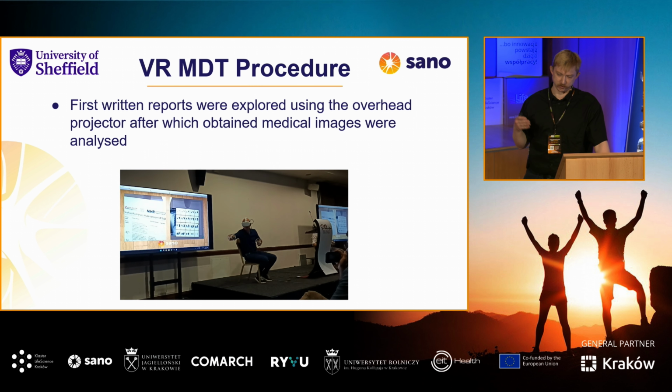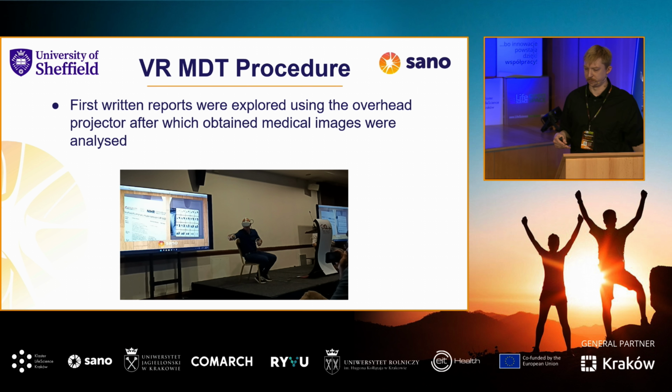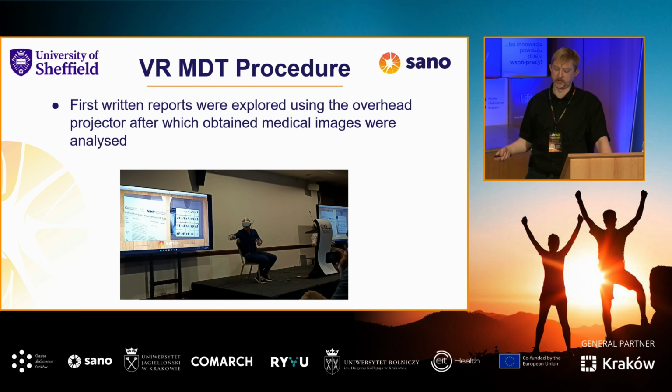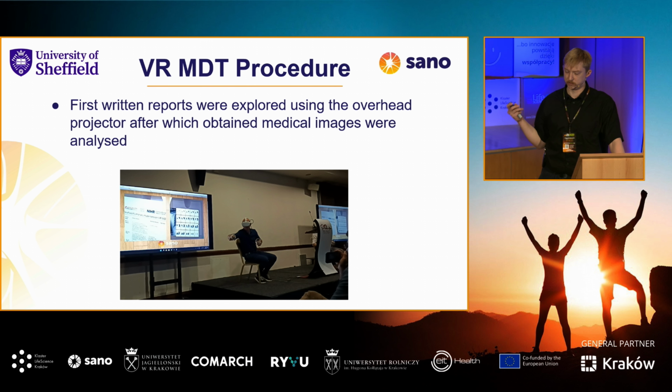The two participants, one radiologist and one clinician, first talked through the written reports inside the virtual reality environment, discussed the specific points, then went through the imaging and discussed that, essentially everything as they would do in a normal real-life meeting, but in virtual reality.